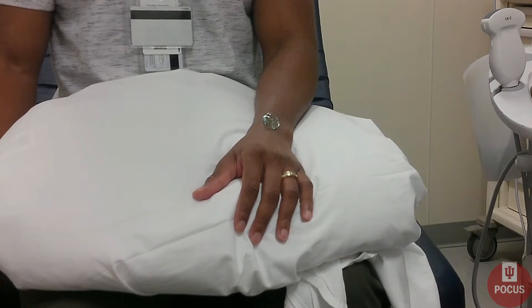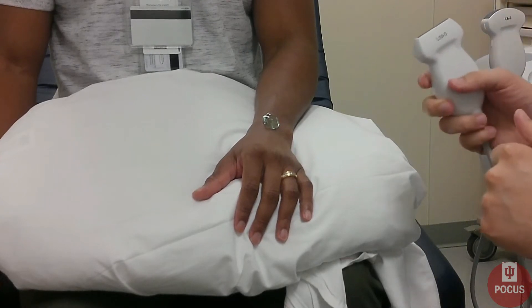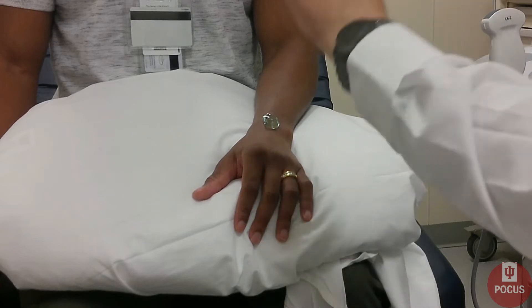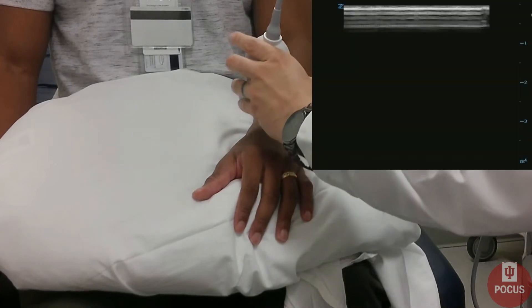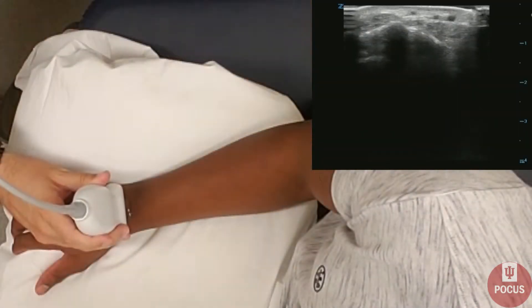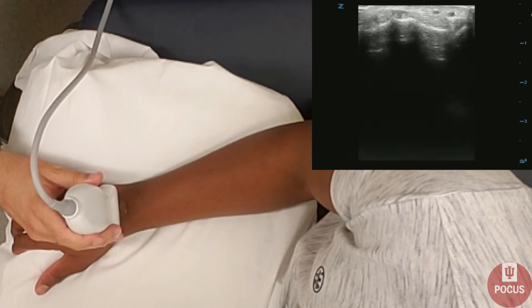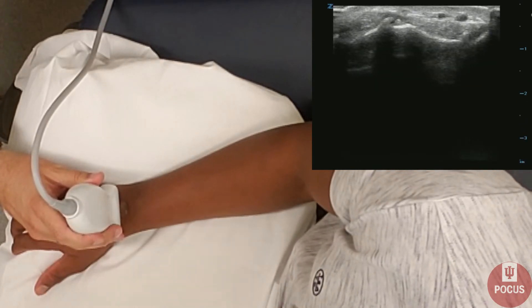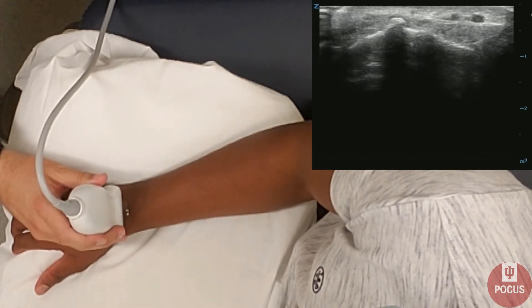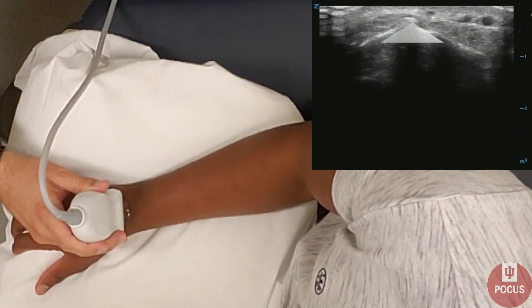Make sure when you're doing point-of-care ultrasound that you always identify the marker dot and place that on the right side of the patient. So we'll start at Lister's tubercle — it's going to be a triangle-shaped cortical bone in the center of the screen here.